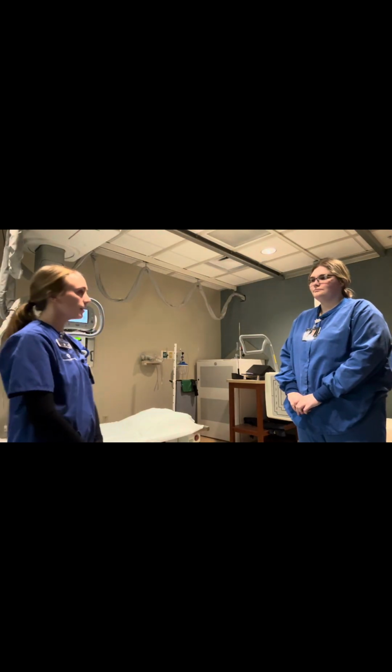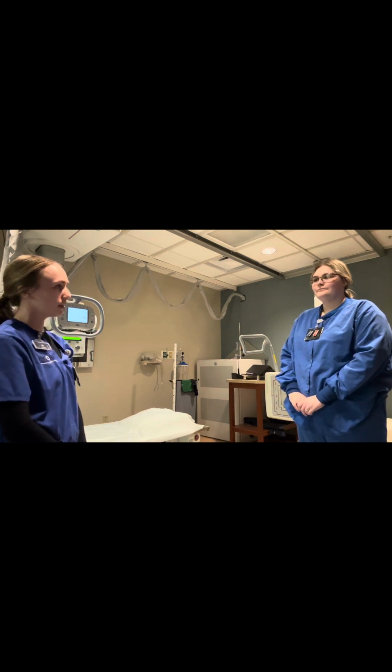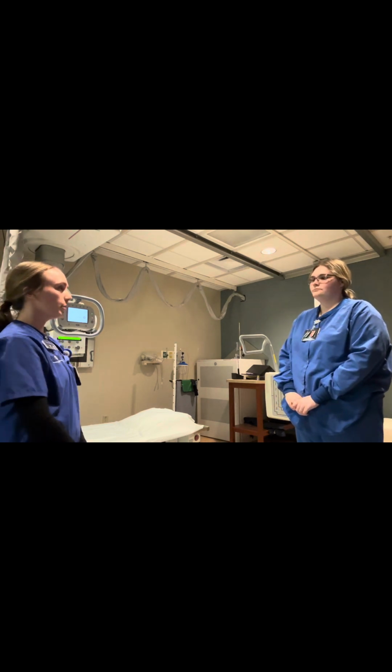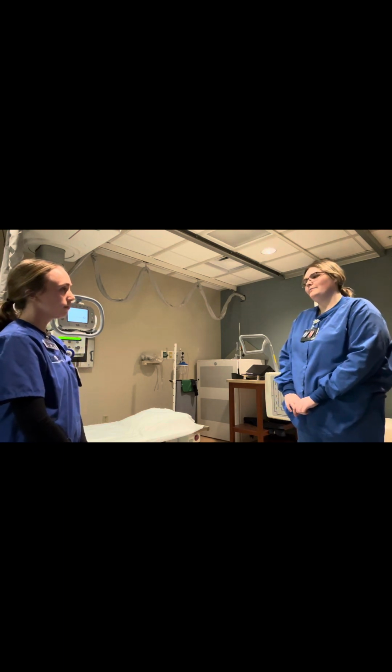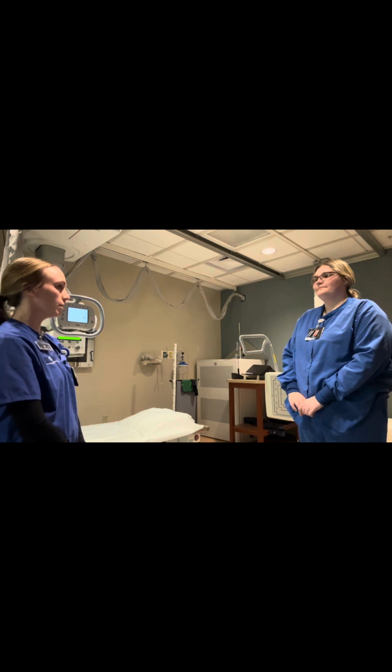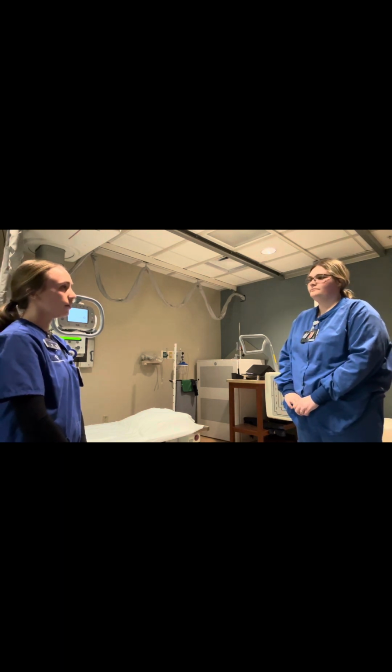Okay, can I get your last name and date of birth? Weimer, 62804. Okay, is there any chance of pregnancy today? No. Alright, so why are we doing this exam on your tib fib? My doctor wanted to know my bone development. Okay, just some updated images. Yep. Are you having any complaints? Just some chronic pain. Okay, sounds great.